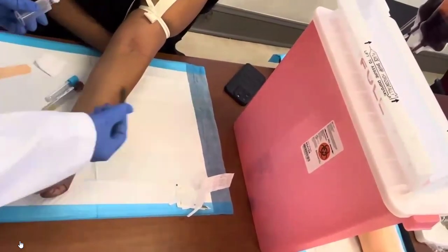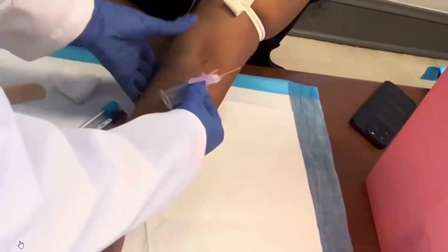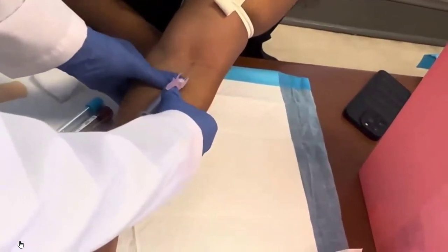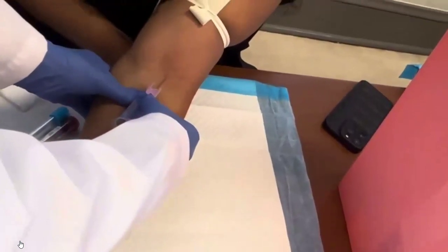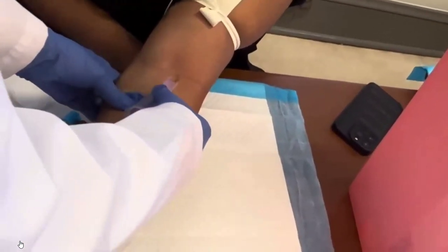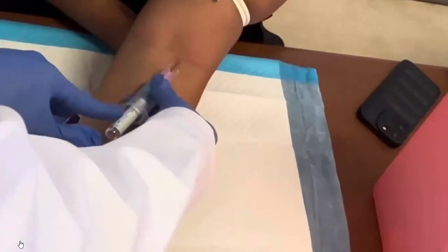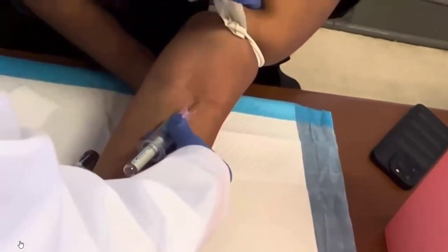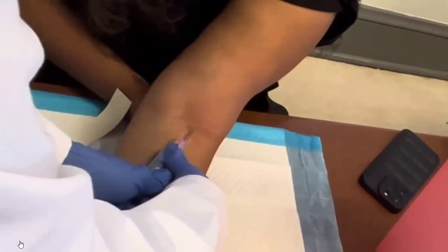Now I'm going to take my cap off and I'm going to hold her arm right here and I'm going to taut the skin. Pulling the skin taut also allows us to anchor the vein so the vein does not move, okay? So I'm just going to go here, my bevel is up. So I'm going to go in there. I'm only going to draw this one tube. Now the blood is flowing, so go ahead and open up your hand. We want to pop that tourniquet. Remember, tourniquet, tube, needle. Okay, so we're going to remove that tube.